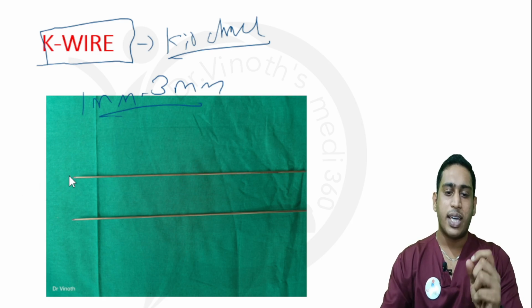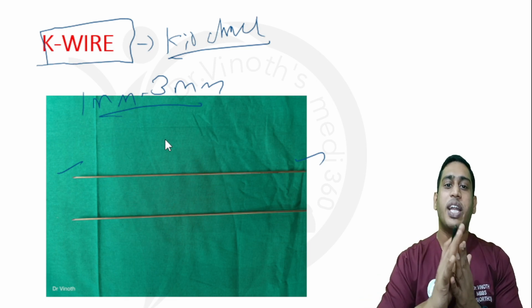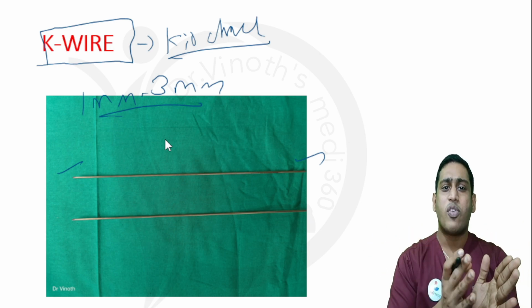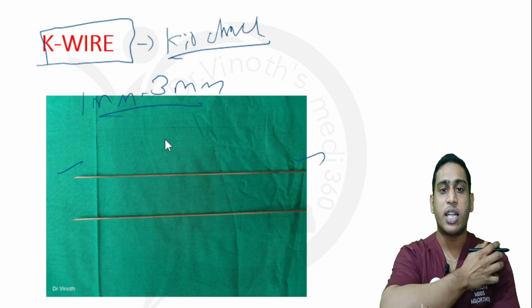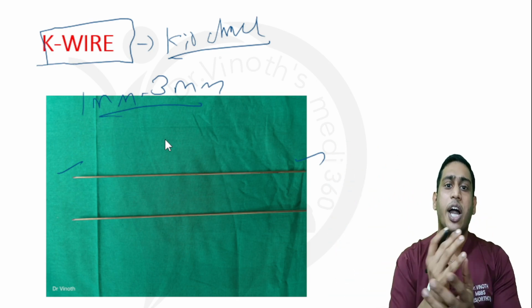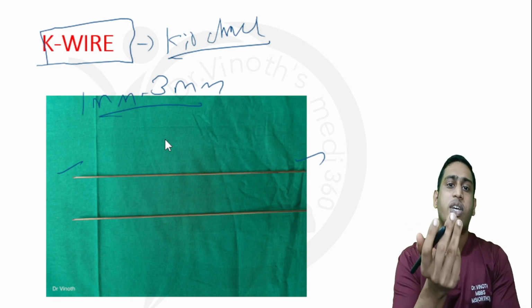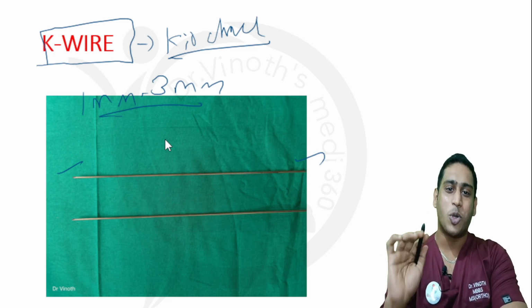They will be having a sharp pointed tip on both ends. This is also important. They are of different lengths also. A very long K wire is usually used for Ilizarov fixation. If it is comparatively around 15 to 20 centimeters, they can be used for fibular shaft fractures, and even for radial shaft fracture and ulnar shaft fracture. K wire has n number of uses for articular or extra articular fractures, like supracondylar fractures in children, which we routinely fix with K wires. So K wires are part and parcel of orthopedic surgery.